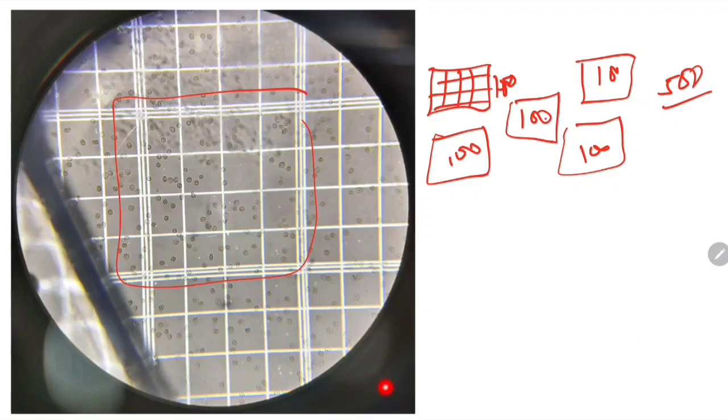And one thing, if you are counting one extra cell, I already told you the importance of the triple line. Left and upper should be included: any cell touching the left and upper border of the middle line, the middle line is a reference line, then you should include it inside the box. And with the same formula, if any cell is touching the right and lower line of the middle line, you should consider the next cell, or discard it, because we are not going to count the next cell, but we should fix it with the formula.